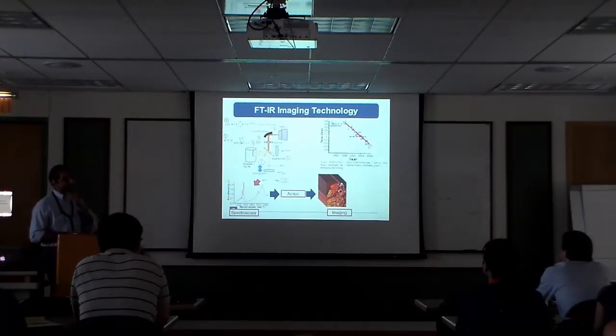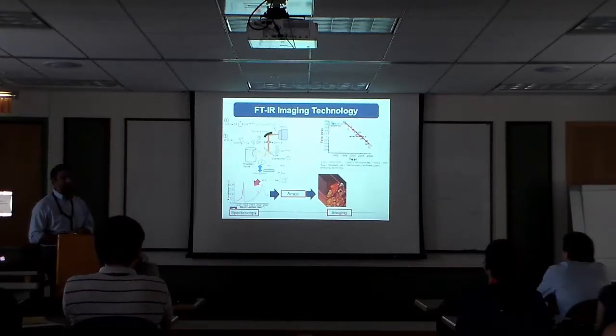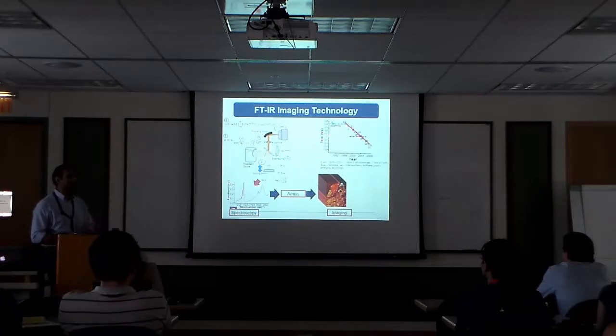Over an almost 15-, 17-year period, this technology has really dramatically changed. The only reason this appears as a straight line or a steady march is because this is a log scale. So you have to see how rapidly this has changed. We stopped counting a couple of years ago because the technology fundamentally changed, and I'll show you what happened there.